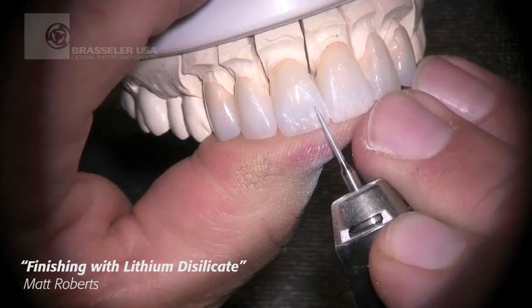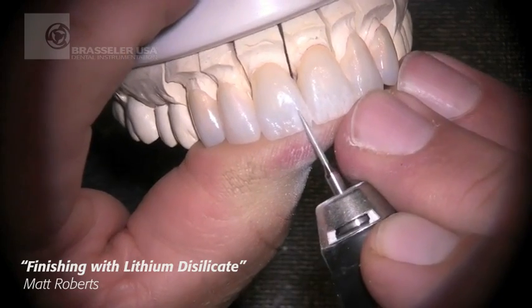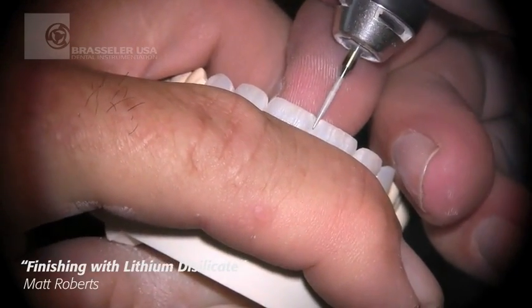Again I'm coming back in with my 863 to very specifically and carefully blend that, and work out all of my aesthetic shapes and forms as well as my surface texture.